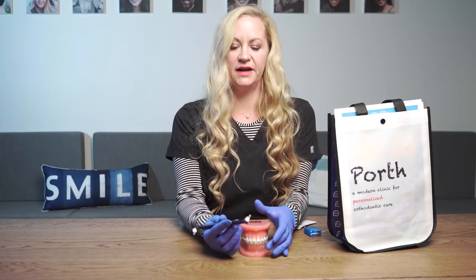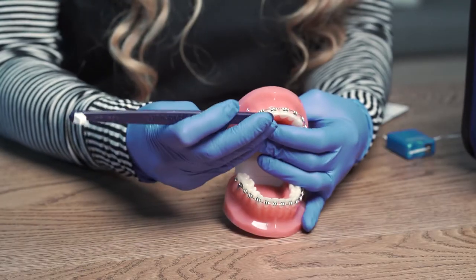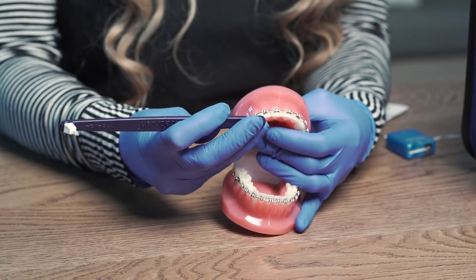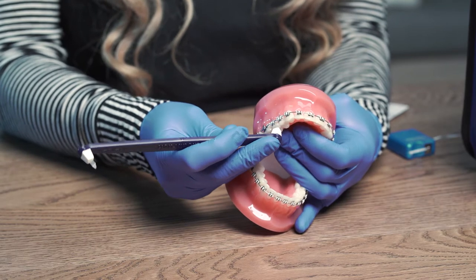We'll also provide a brush that will help you get in between the hard to reach areas. Slide that through up underneath — don't force it, otherwise it could cause a loose bracket.